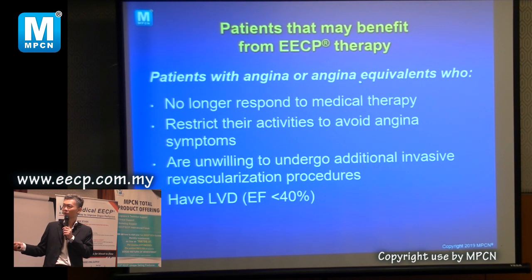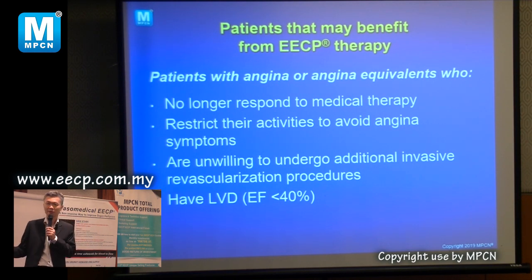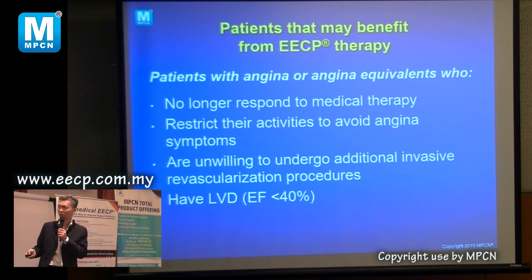If they have a lot of chest pain, angina, when they are doing their activities or when they are at rest, and you have ensured that they are on the right medicine, and they still have symptoms, then this therapy is useful for them. And if these symptoms stop them from doing activities like going out, and you are stuck in the home, then this treatment also is good.